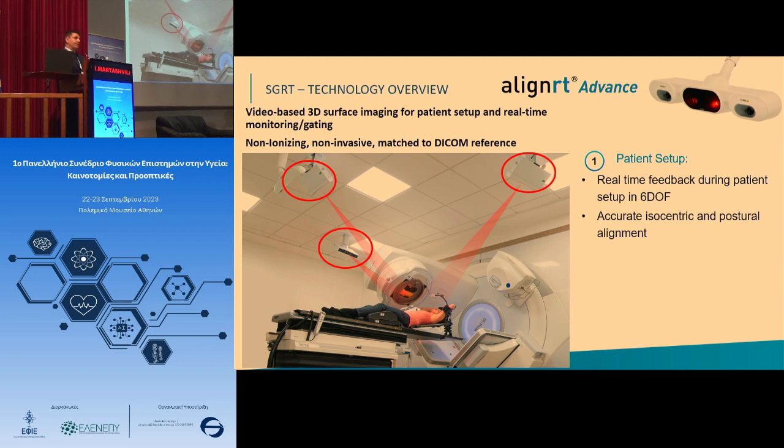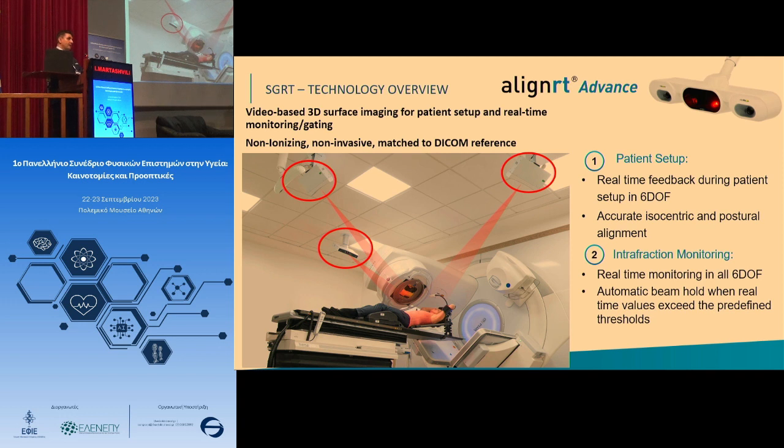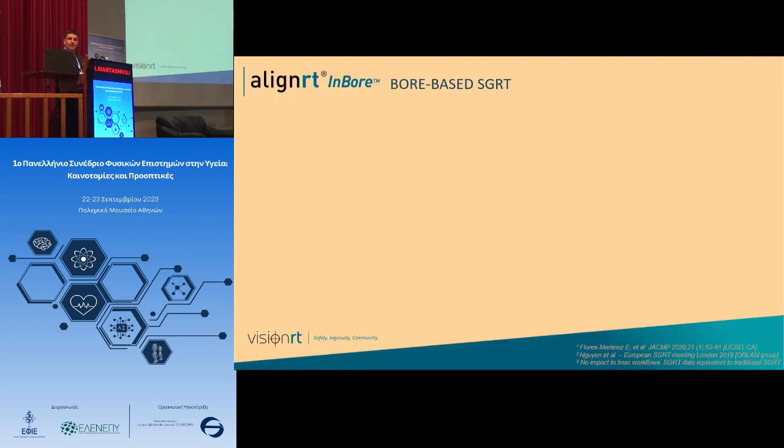So when we do a real-time fusion of the patient's live position to our reference position, we can utilize it for two main aspects. And the first one is the patient setup. So we can repeat the same geometry, same patient orientation every day on the machine table. And the second aspect is also motion monitoring for the treatment. So we can, again, make sure the patient is staying in the same position, it's not moving, and if we have a connection to the linac, we can actually hold the beam and pause the beam if the patient moves out of tolerance.